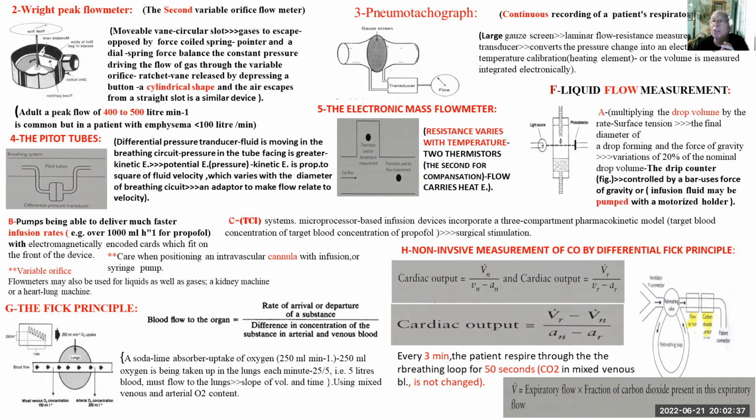Whenever I want to estimate the cardiac output, I have two equations. The first equation is the non-rebreathing, the normal one: the carbon dioxide volume estimated from the apparatus over the arterial-venous difference in carbon dioxide content. On the other hand, if the patient is rebreathing, I can create another equation. We call it the rebreathing equation, from these two sensors, as we can see on the right side.